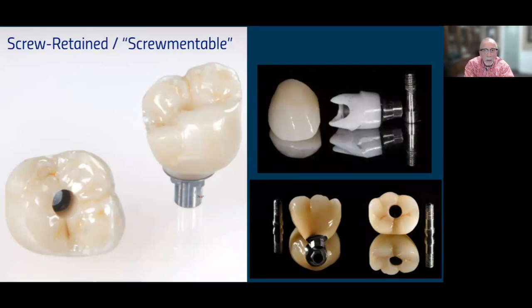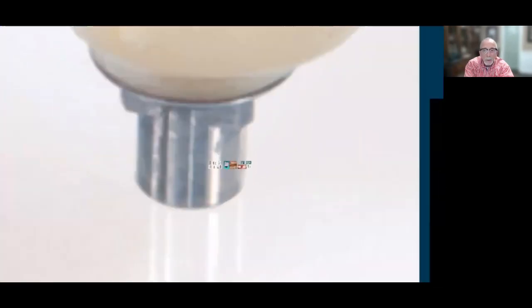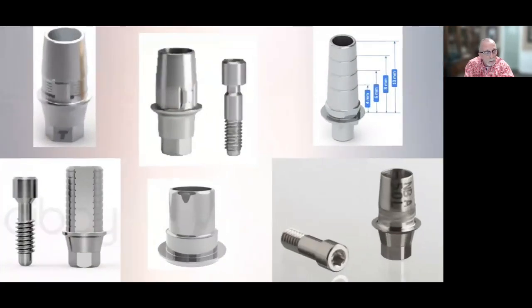So my favorite was a custom, but I went through a period where I did a lot of the stock parts, right? These were called originally tie bases, and several manufacturers came on the market with them. They were very popular and still are, I would say, mainly because of the cost. They are a half to a third of what a custom abutment might be. So we can do them more affordable. And so, of course, I jumped in on this like everybody else did, and it was great.